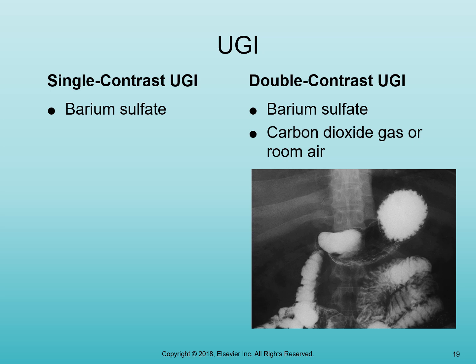We had talked in the other lecture video that an upper GI procedure could be either single contrast, where we use one positive contrast media, and that would either be barium sulfate, which is a colloidal suspension, mixed to the consistency of the radiologist or the fluoroscopist preference, or you could use the water-soluble iodinated contrast media if the patient did not have any iodine allergies or iodine issues.